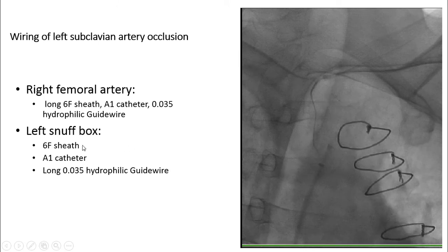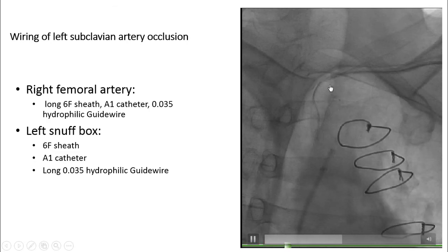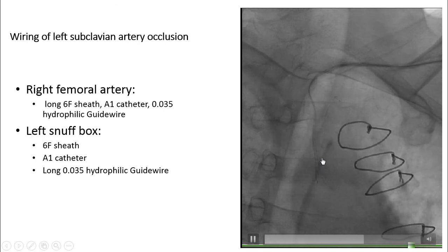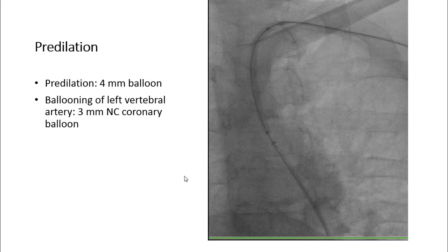After that, we used our left snuffbox access with a 6 French sheath, AL1 catheter, and a long 0.035 hydrophilic guidewire, which was easily passed from the distal part of the occlusion into the proximal subclavian artery and into the aortic arch. After that, we snared the wire from our right femoral artery access sheath, so we now have a wire running from the right femoral artery access through the lesion and out through the left snuffbox.